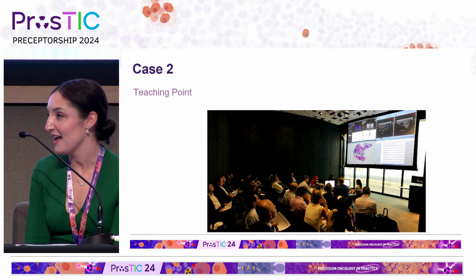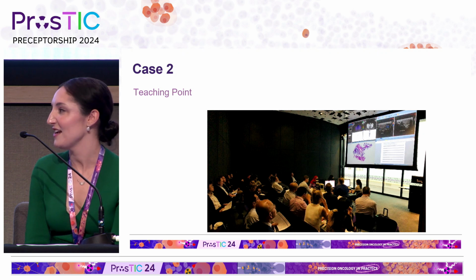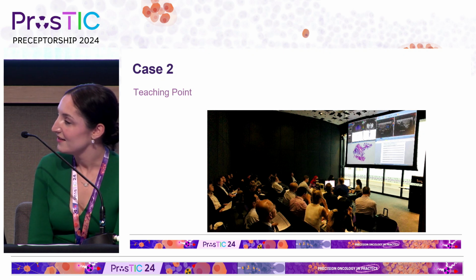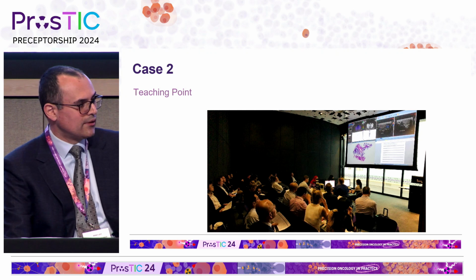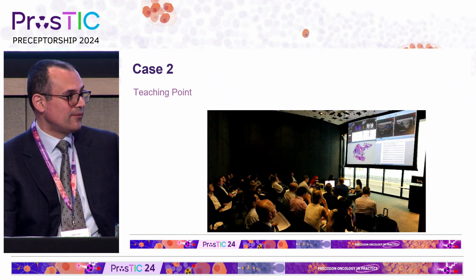It was PSMA and FDG avid in a patient with a history of localised melanoma, and it ended up being melanoma. So is there any way to differentiate the etiology on CT and PSMA PET, or in those situations is biopsy really needed? Sometimes with melanoma there are particular features in MRI that can help, but unfortunately the most helpful thing is old imaging and the fact that it hasn't changed over time.